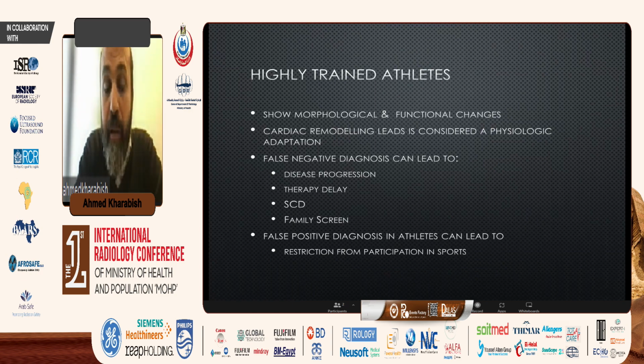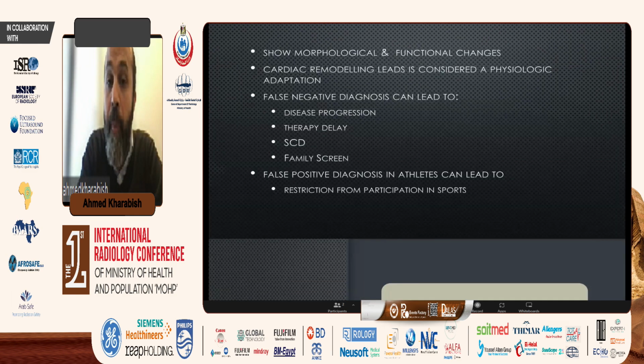If it's a false negative, this might lead to a subsequent cardiac event or missing a family screening in a cardiomyopathy, for example. A false positive might lead to a restriction, asking an athlete to stop participating in sports. So the impact of the imaging and the differential diagnosis is very high.